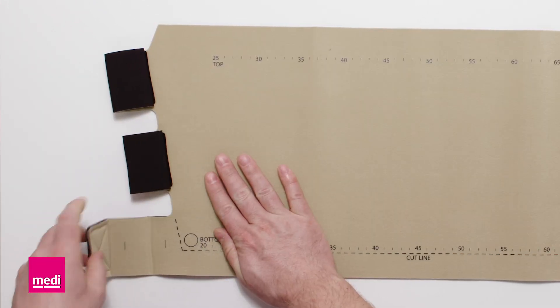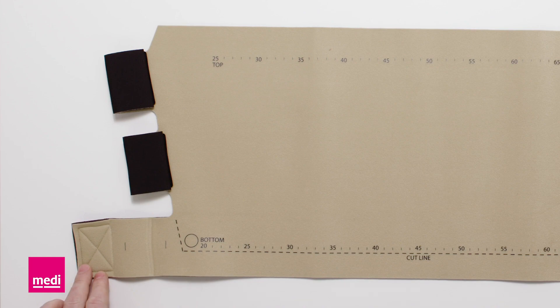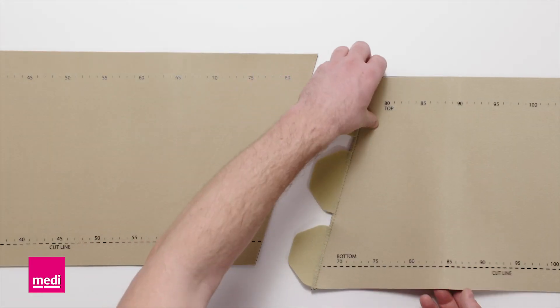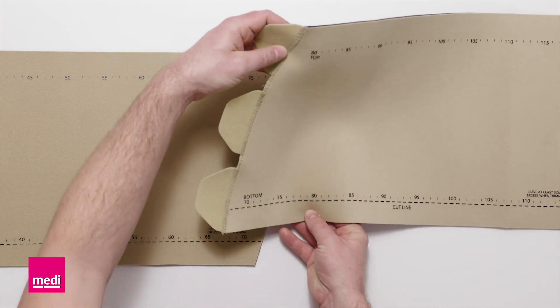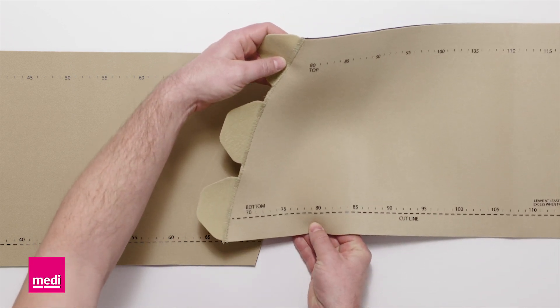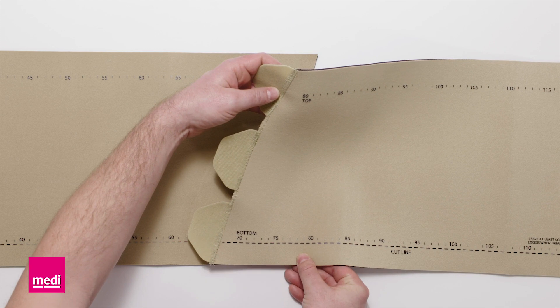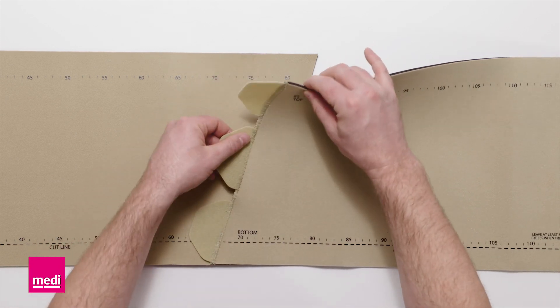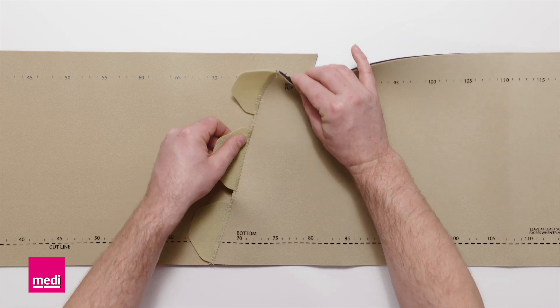Detach the bottom most band to view all of the number markings. If the patient's measurements exceed the printed values, use the Circade Reduction Kit extension. Align the extension on the markings at 70 or 80 cm and attach the hook fasteners.